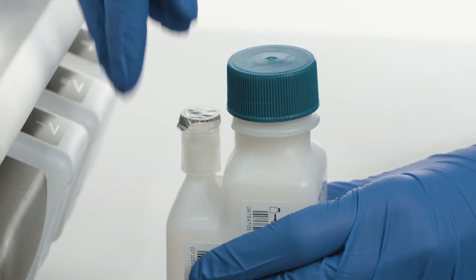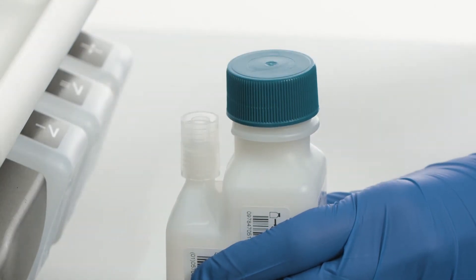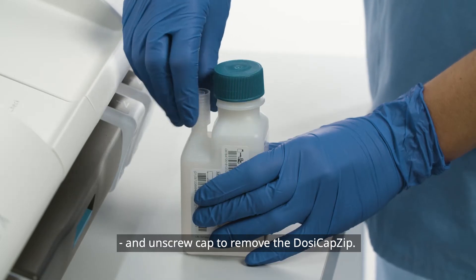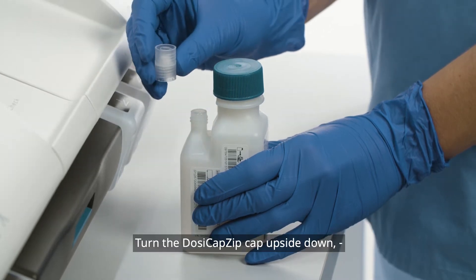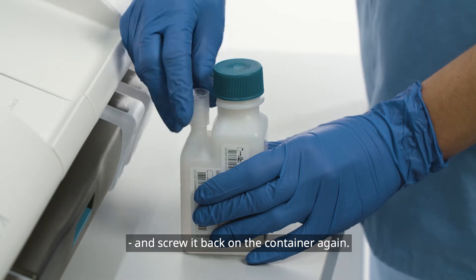Prepare the solution. Remove the foil and unscrew the cap to remove the dozy cap zip. Turn the dozy cap zip cap upside down and screw it back on the container again.